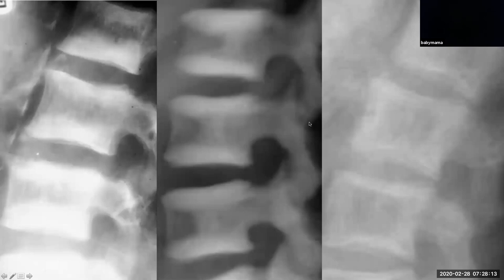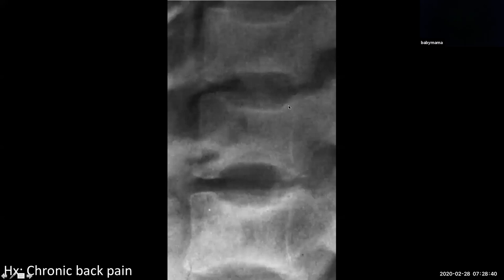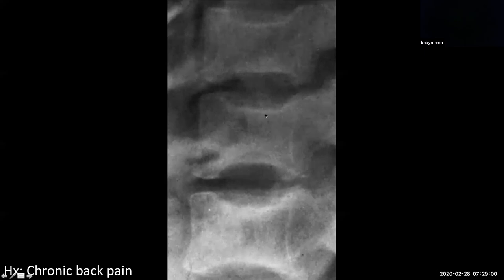How about this case? History of chronic back pain. The alignment on this coned-down view of the lumbar spine is very good, the bone mineralization is a bit heterogeneous, but what catches our eye is the C — the cortices. We can see what's been likened to H-shaped vertebral bodies or fish-mouth vertebral bodies. This is a case of sickle cell disease causing bone infarction — specifically blood sludging causing bone infarction at the end plates or subchondral bone of the vertebral bodies — leading to this H-shaped appearance.